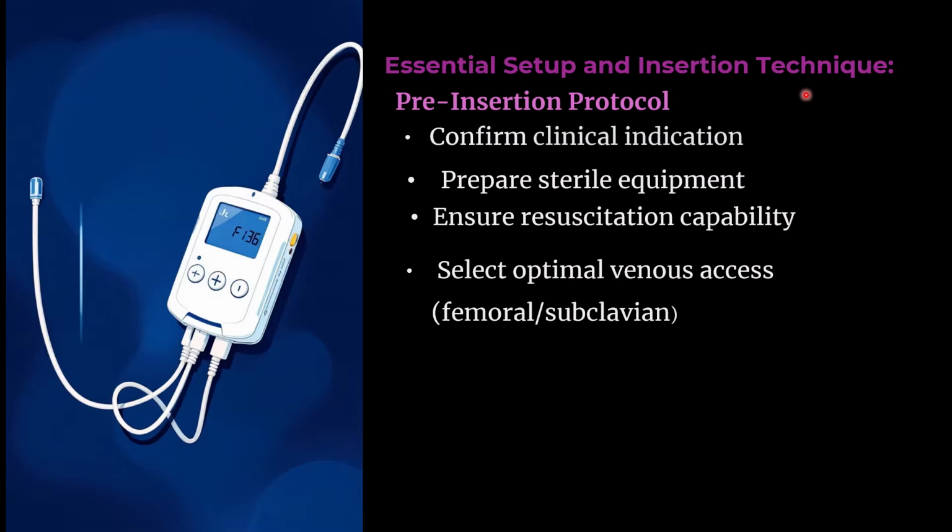Essential setup and insertion technique. Pre-insertion protocol: confirm the clinical indication, prepare the equipment, ensure resuscitation capability, and select the optimal venous access, which can be femoral or subclavian vein. The choice of venous access depends on the operator and the patient's clinical status.